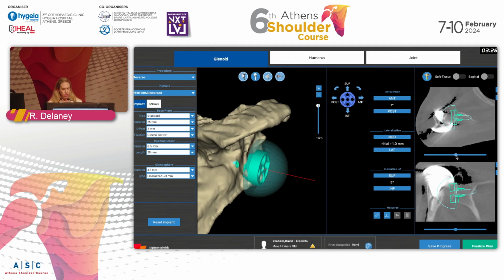software being always available since they've begun doing arthroplasty. You've got to remember that there's soft tissues, there's the brachial plexus, there's tension on the acromion, so there is a limit to what you can do. And the software is not going to tell you that. You have to still be the surgeon and remember that.